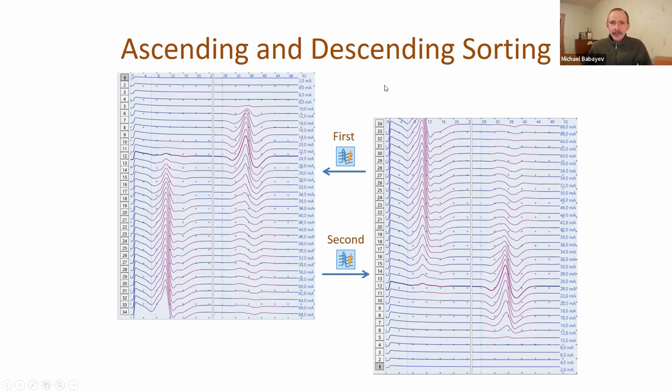We changed the behavior of the sort traces by stimulus button. Previously, clicking this button sorted all traces from lower to higher stimulus level (ascending). Now when you first click this button it still sorts ascending, but you can make a second click on the same button and the traces will be sorted in descending order - from higher to lower stimulus intensity values.